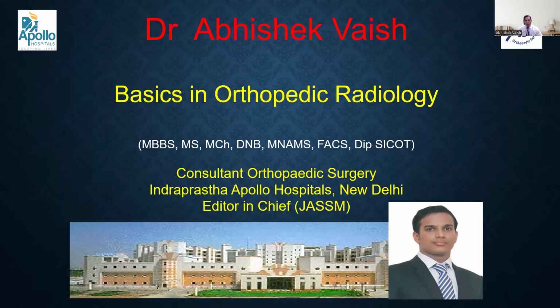We will talk about a lot of MSK modalities, but our main focus will be on X-rays, ultrasound, and MRI of the lumbar spine, shoulder, and knee. We can take the questions at the end, and I would be happy to answer any questions which you may have. Feel free to ask any questions at the end of the lecture regarding this lecture or in general as well.